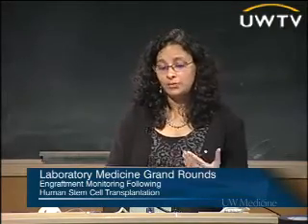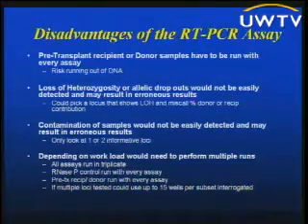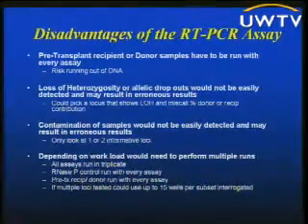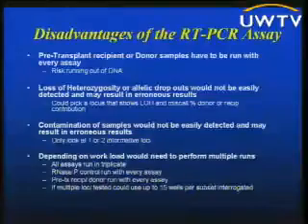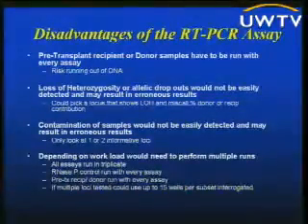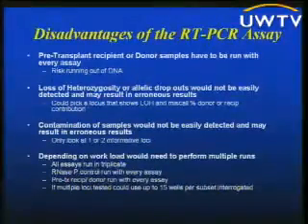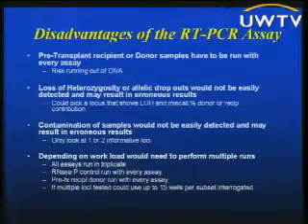The other thing is that you have to run a calibrator, which is the pre-transplant recipient or a donor sample, every single time you run this assay. So you can imagine you risk running out of DNA very quickly. There's also problems with the fact that you wouldn't recognize loss of heterozygosity, especially if you're restricted to using just 1 or 2 alleles. And if those are the ones that are lost, you would erroneously call your results and miscall percent donor or recipient.